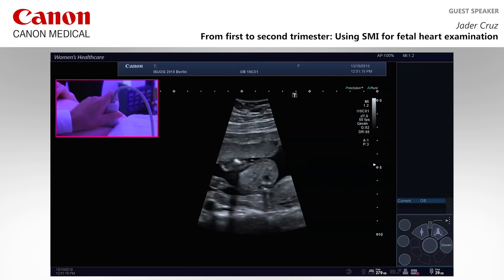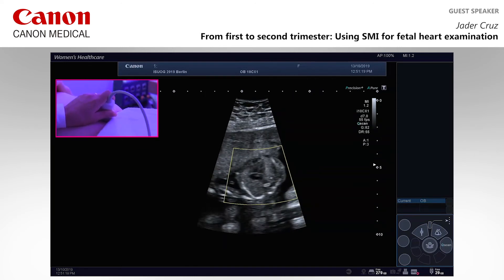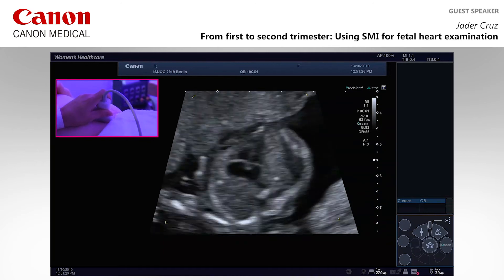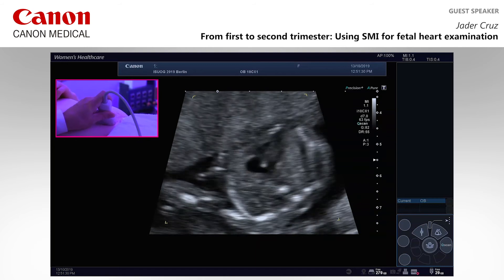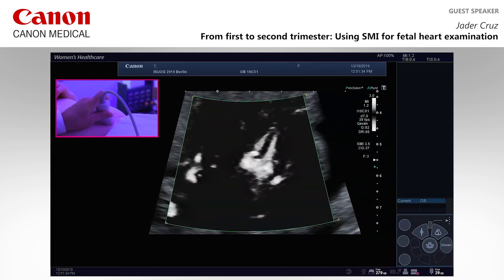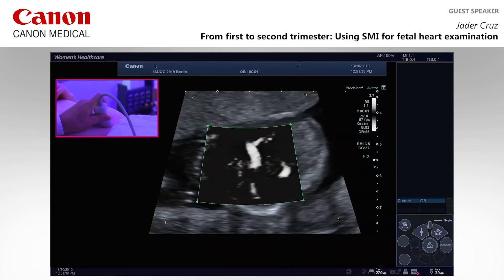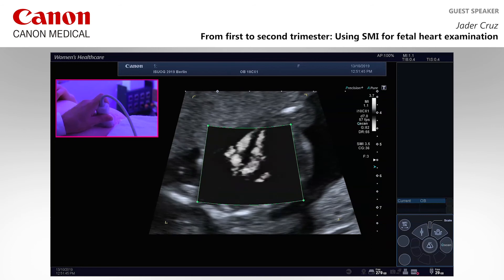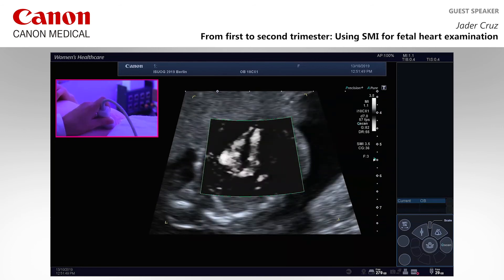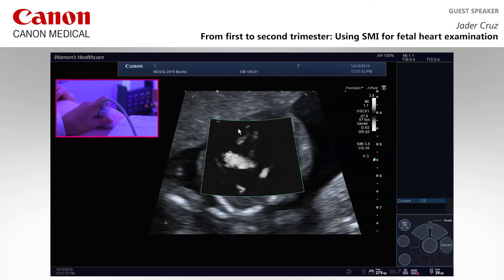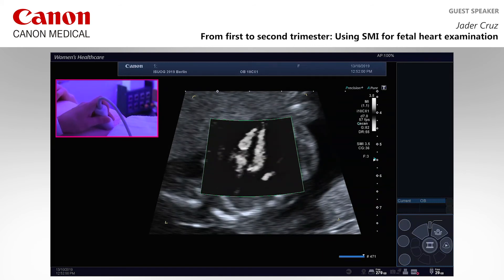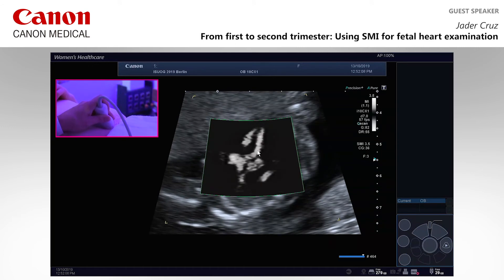We move here to the heart. There is the baby — 17 weeks. 20 weeks would be nicer to show, but you can see. We will switch on the SMI. We need to play a little with the presets, and you can see we still have some noise. But if you focus on what we're talking about, using CineLoop you can clearly see the interventricular septum and there you see the aorta.